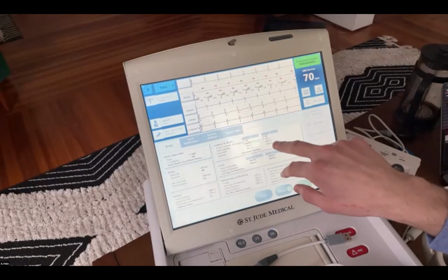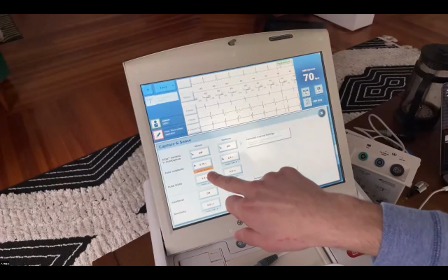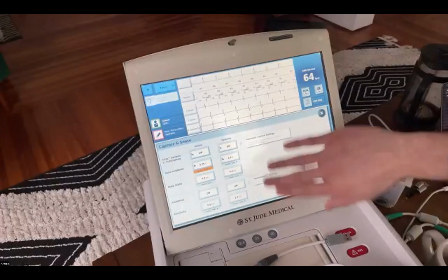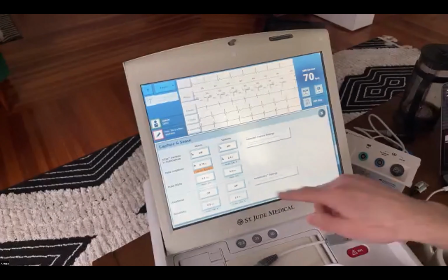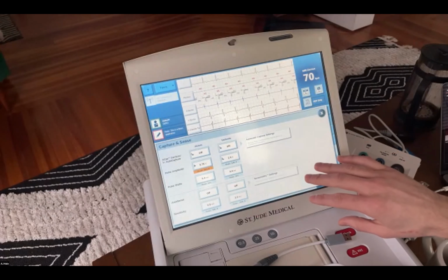Let's see. Okay, there we go. So here I went below margin, it highlights it and says, hey, your margin is only 1.2 to 1. So it's just a little warning here to make sure. Just remember, outputs in Abbott devices above 2.5 volts tax the battery a lot more. So in those cases, playing with the pulse width can help. Once again, call us if you have questions.